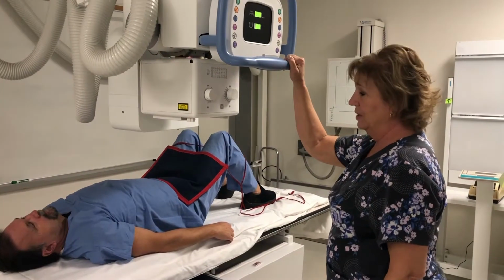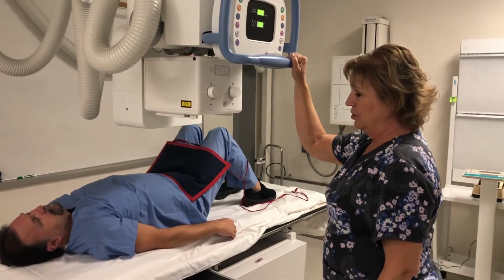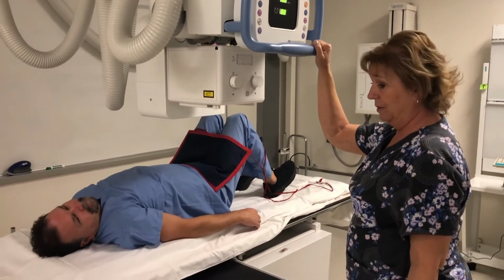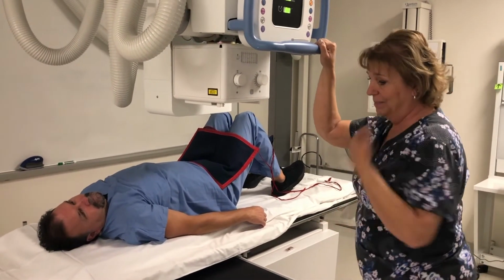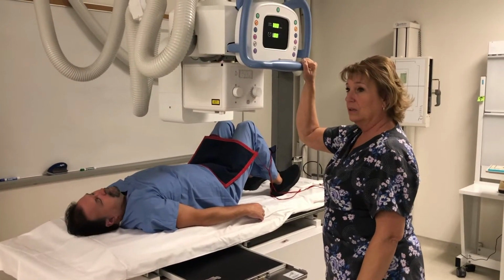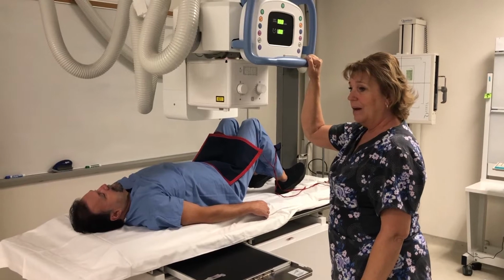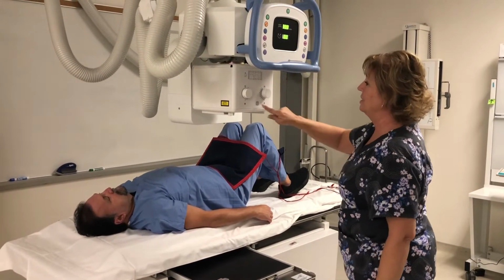Now we're moving on to thoracic spine. There's generally just an AP and a lateral and then a swimmer's view, but we're also going to demonstrate AP obliques. I don't know of any clinical site that actually includes AP obliques as part of their protocol. However, it's potential on the ARRT, so we're going to teach it.